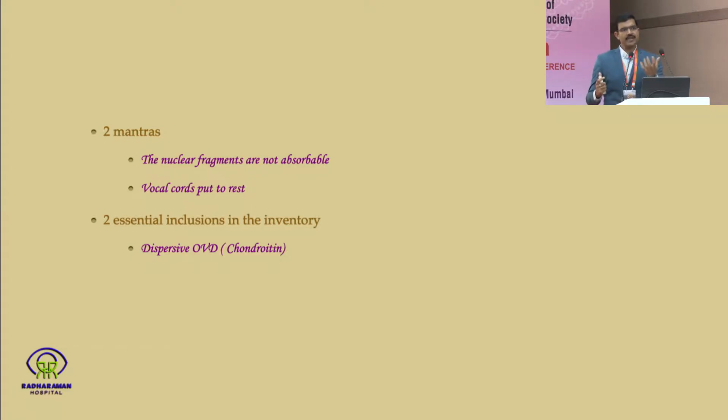It also protects the capsule, provides a capsular bandage sort of thing, and gives us the space to operate upon. We'll see that in the form of certain videos later on. And the other is, of course, the multi-piece IOLs, PMMA or foldable, both for sulcus and bag, whichever you need, can come into play. The third 2 that I would be sharing with all of you is the 2 points to ponder.